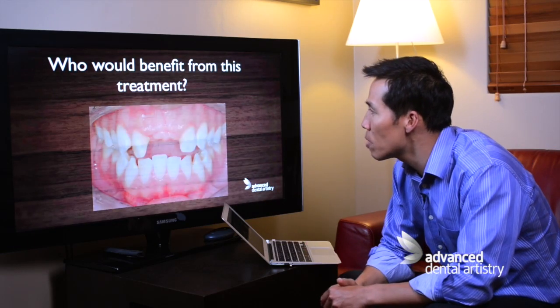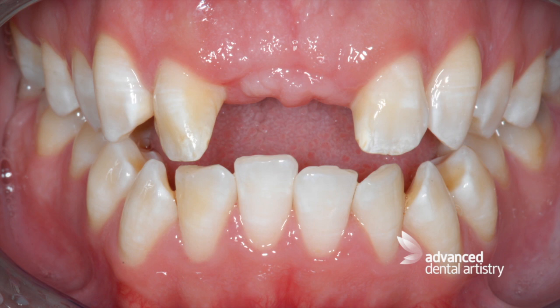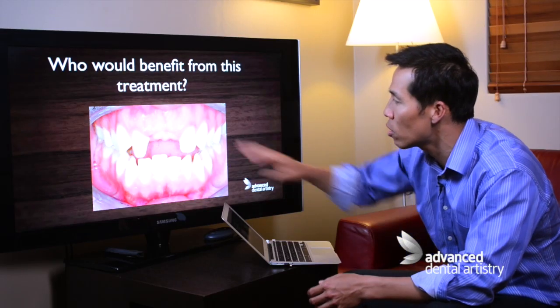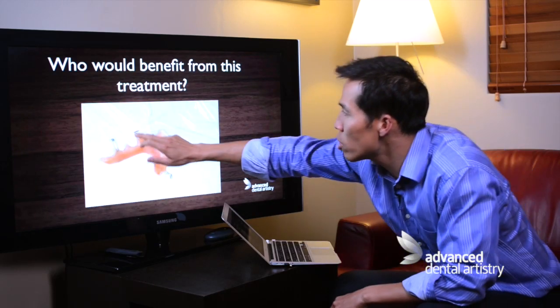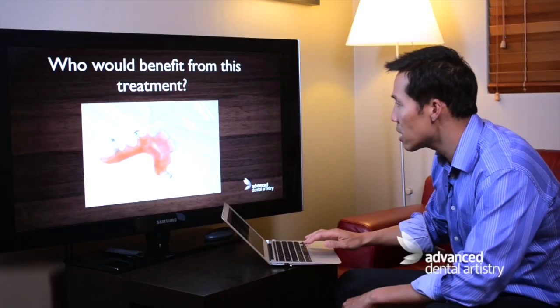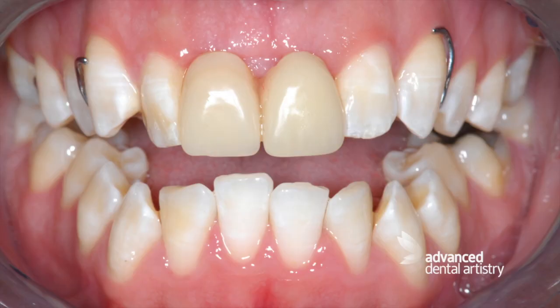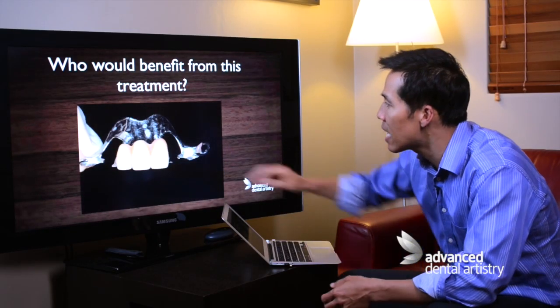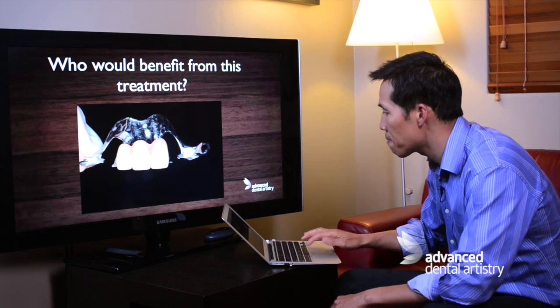So who would benefit from this treatment? Anyone that's missing teeth, and I suppose front teeth are always a problem. If you're missing front teeth due to trauma, like this patient who had a football accident and lost their front teeth, they will normally have a plate, and a plate will usually have wires, always made out of plastic here, and the wires are there to hold the plate in place. If you look at what it looks like in the mouth, you can see these wires, and you can also see the difference in the color of the teeth. Sometimes chrome plates are made, but again, they still have the wires, and chrome plates tend to fit better, but again, they are removable and have to be taken out every night.